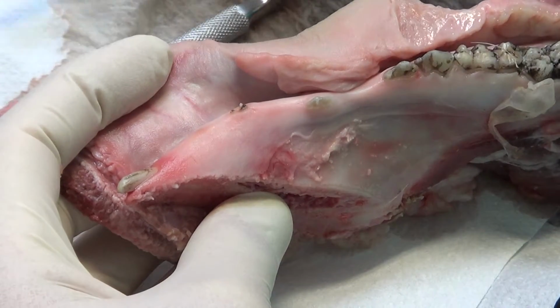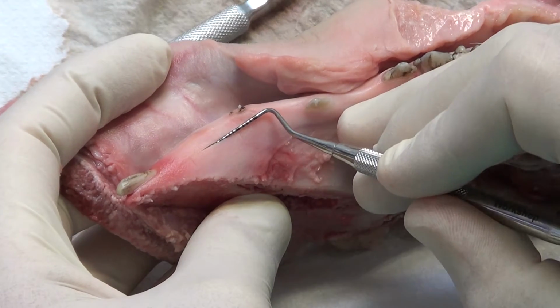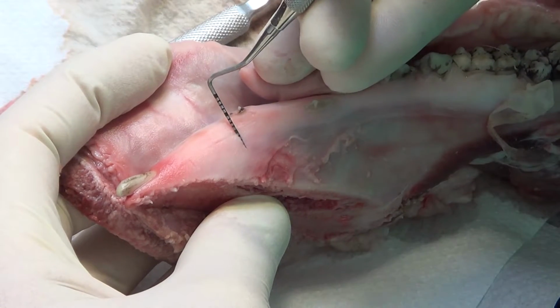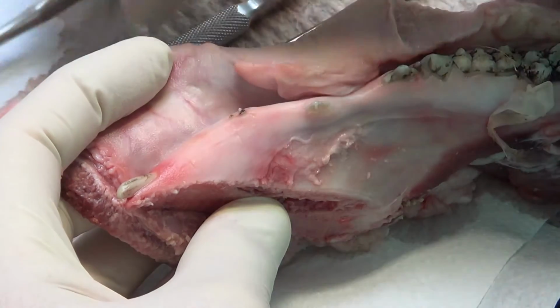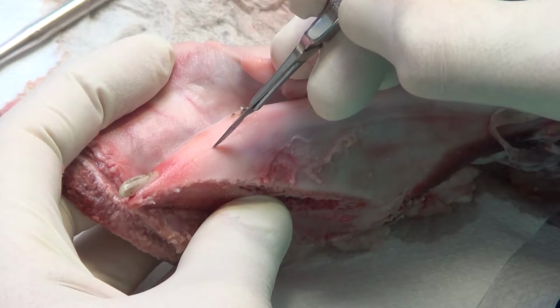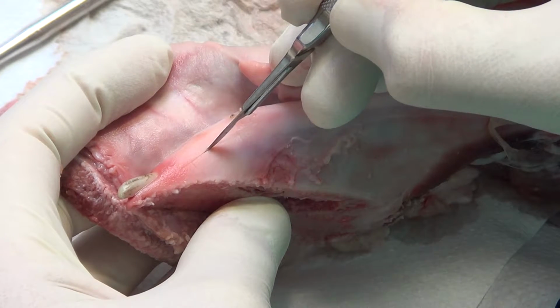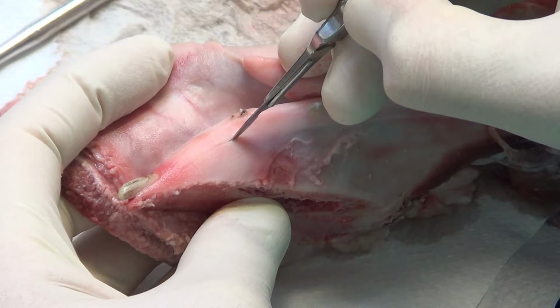1 centimeter length. Mine I obtain a little bit more than 1 centimeter, and then 2 vertical incisions of 4 millimeters. Okay? In this case, we will stay a little bit superficial, so try not to go too deep. 2 millimeters, only with the tip of the blade. Okay? Like this.